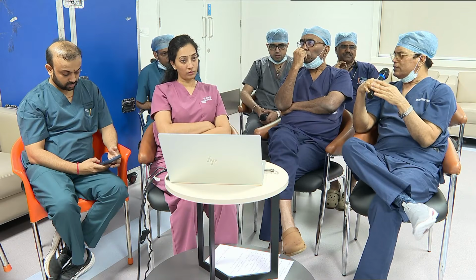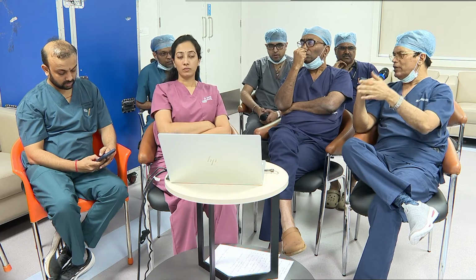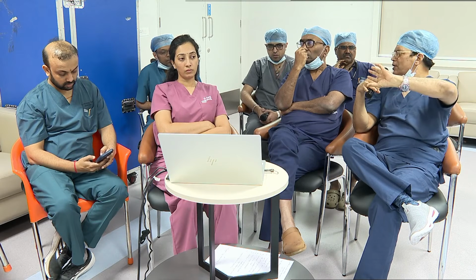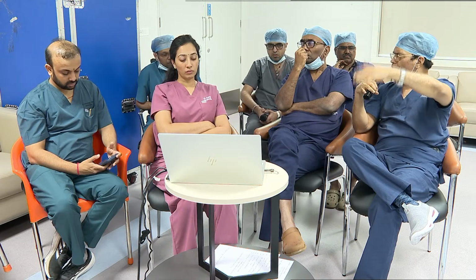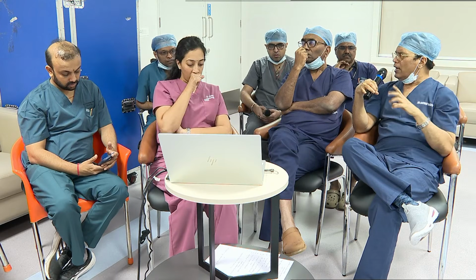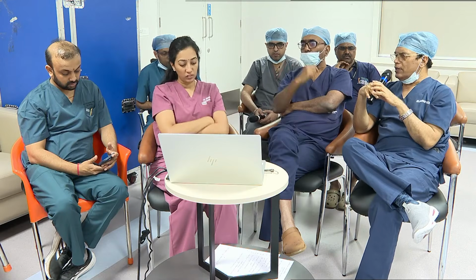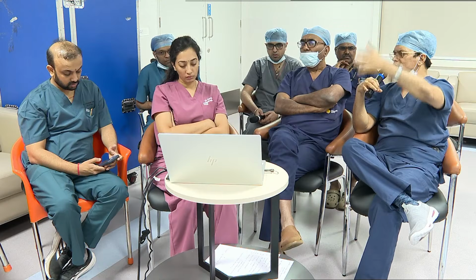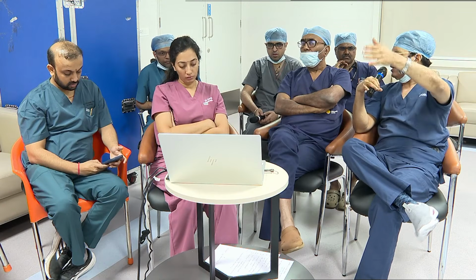You can only use 6 or 7 diameter, dilate it, and modify the plaque. After that, it passes enough and will allow the flow. So that is important. Only the number of pulses is more and the length of the balloon is more. Here it is 60 mm, so almost 6 centimeters. So it covers the maximum length, whereas the coronary is 12 mm.